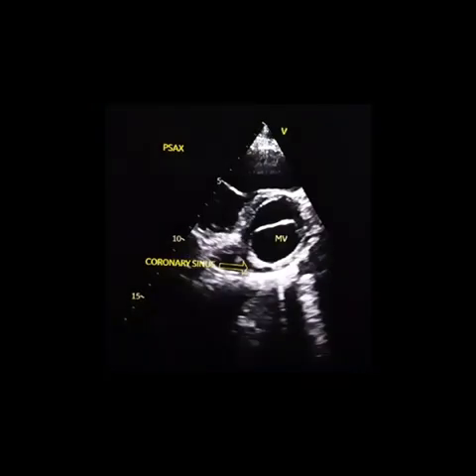This is the short axis view at the level of mitral annulus or the AV groove. You can see the coronary sinus running transversely into this groove, and this is often seen in case of a very good window.